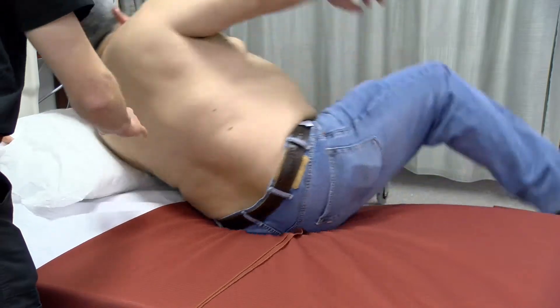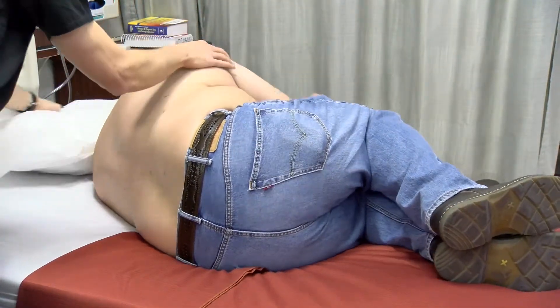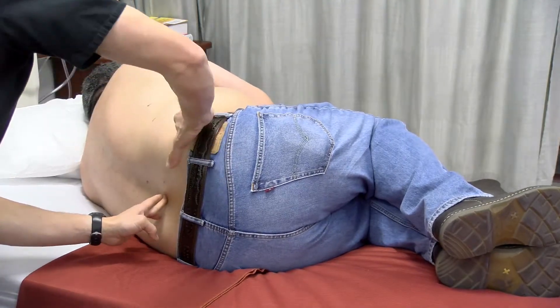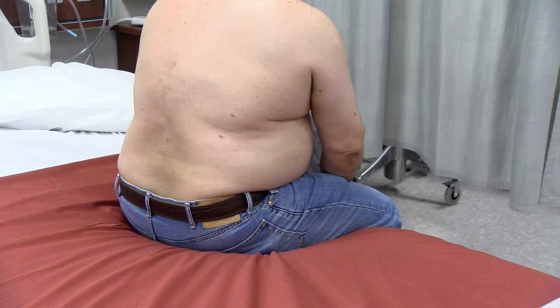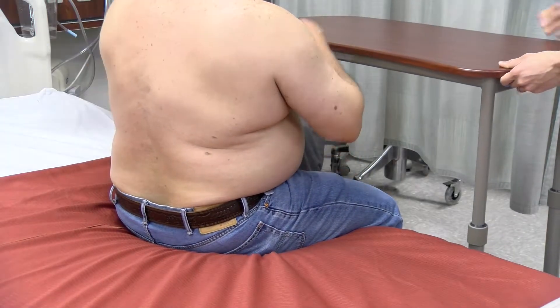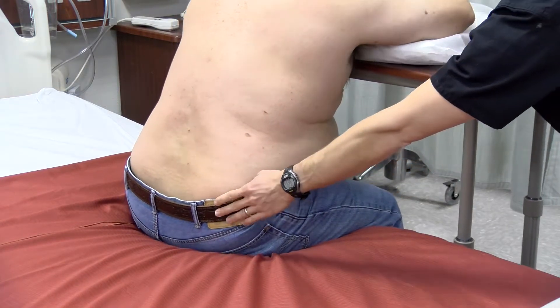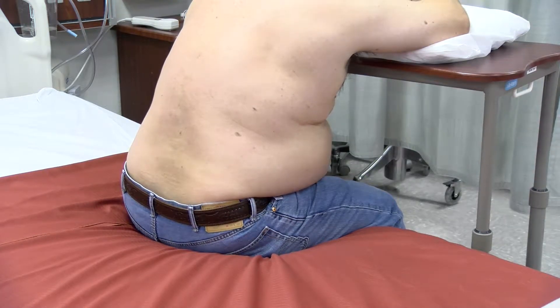The patient may be placed either in the lateral decubitus position with a towel roll under the patient's head to maintain spinal alignment, or in a seated position with the patient leaning over a bedside tray or table. Placing the tray or table against a wall will decrease the risk of it sliding during the procedure. In either position, the patient should flex forward to open up the space between the spinous processes.